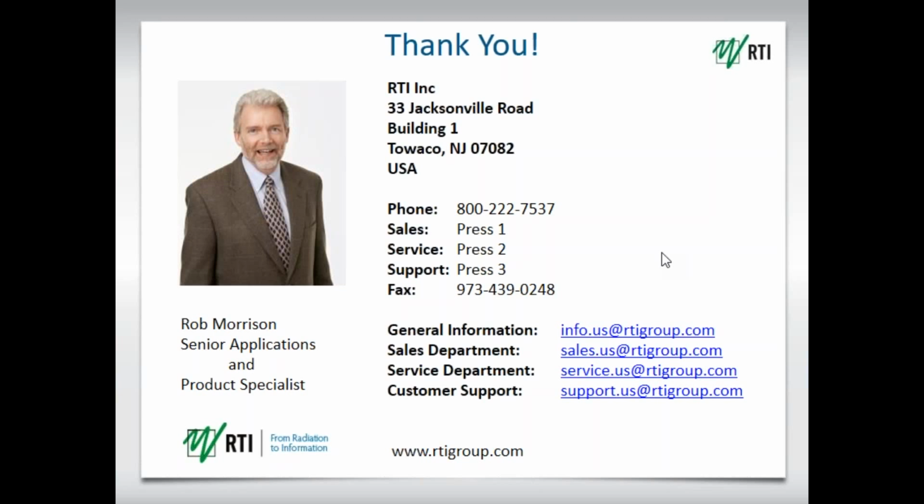The first question I do have is, does RTI Ocean Professional software come automatically with every RTI Piranha? In one sense it does. It comes with Ocean Connect, which is a subset of Ocean Professional. If you want to have Ocean Professional, you have to order Ocean Professional as a separate item.